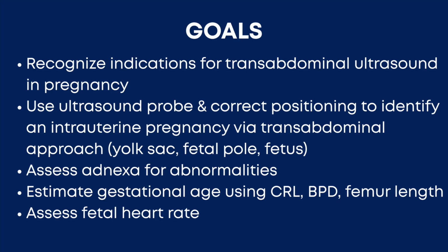And we also wanted to discuss the adnexal assessment and general fetal calculations, including things like gestational age, using the crown rump length, biparietal diameter, and femur length, and then the fetal heart rate.